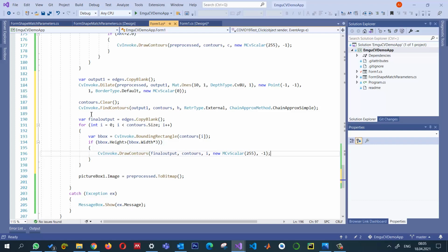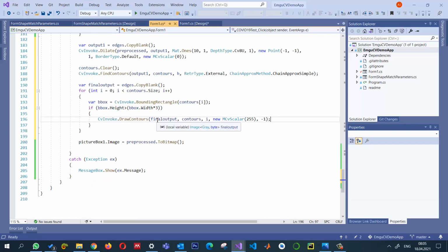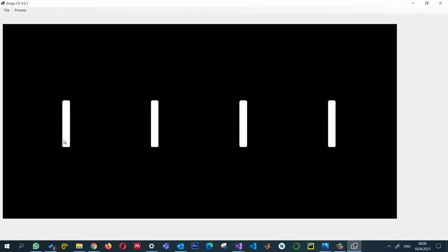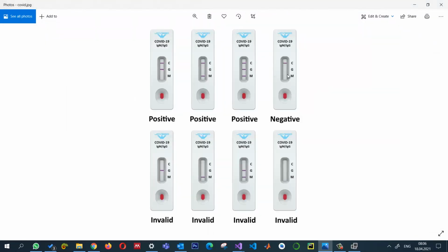By the way, once we do this, we can check the final output before going further to see if everything is going in the right direction or not. And you can see this is perfect. So this is what exactly I wanted, and I get the strips. Now, once I know the strips, then I can count the divisions inside it. If we have only two divisions, then that is a negative case. In rest of all these cases, we can say it is a positive case.